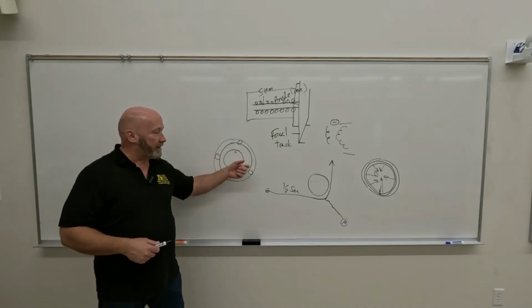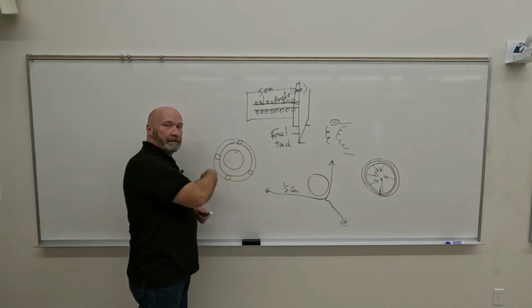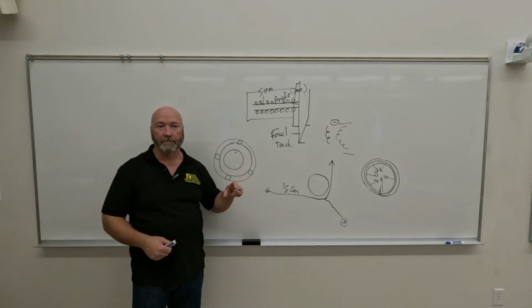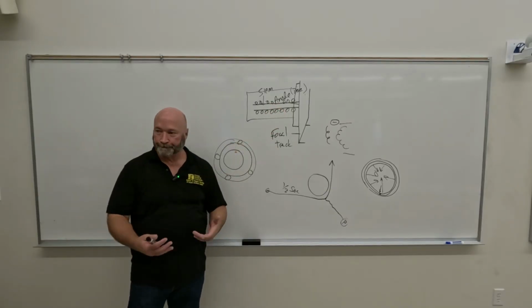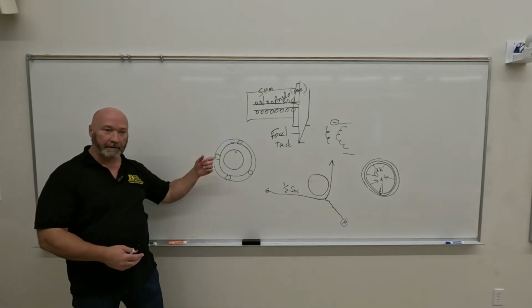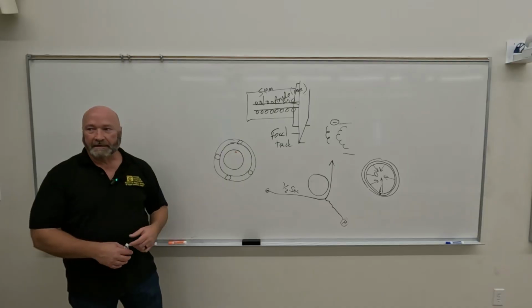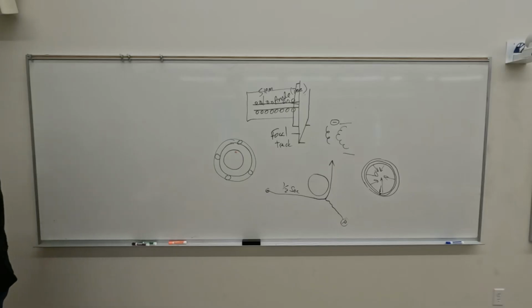So it fires, let's say it fires this way to start the rotation. Once you make your exposure, it starts rotating that way, firing in sequence in the opposite direction to take you back down to 0 to prevent you from overusing your bearings, creating more heat. Okay, so it actually does both. It starts the rotation and it ends the rotation. Minute tops, usually within 5 seconds. A lot of times within a second. There's just no reason to continue to rotate it. Okay.